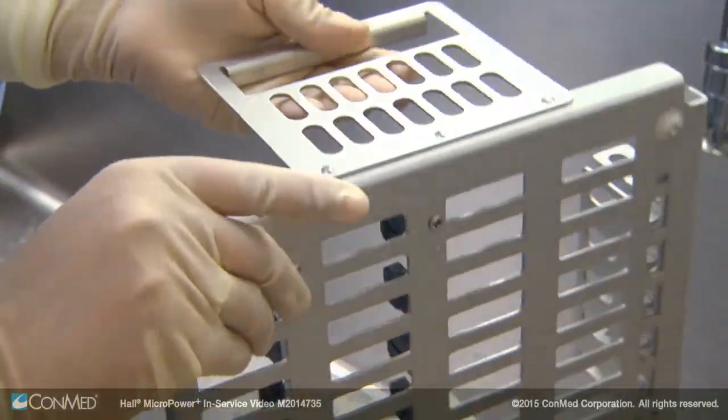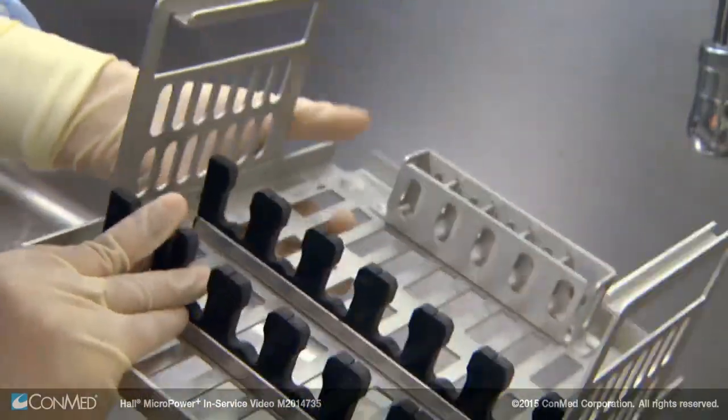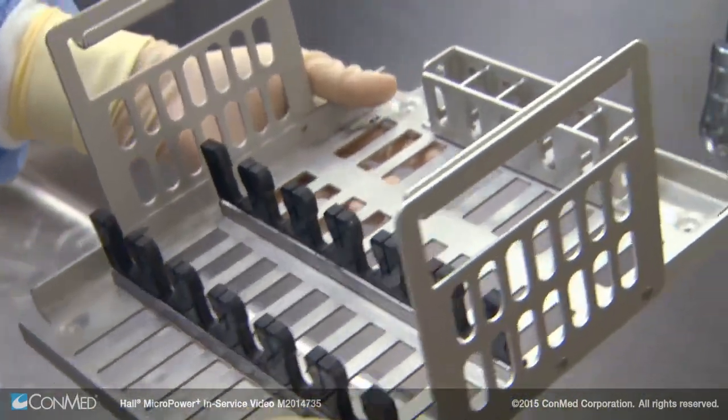Next, it is time to visually inspect instrument trays to ensure that they are free from dents, cracks, corrosion, pitting, or broken brackets.